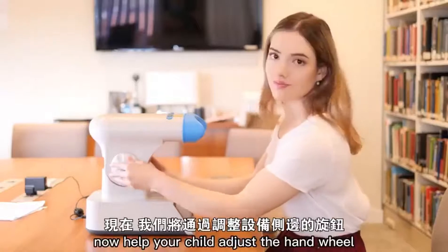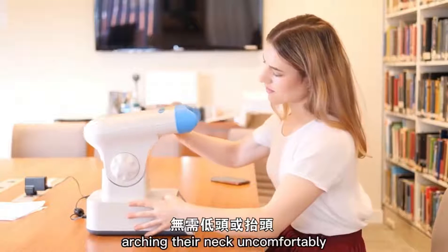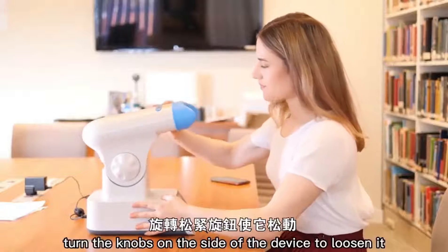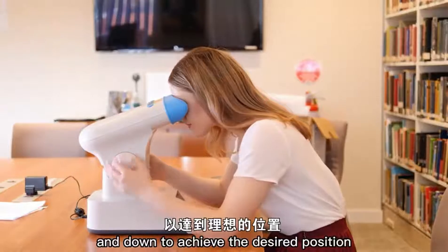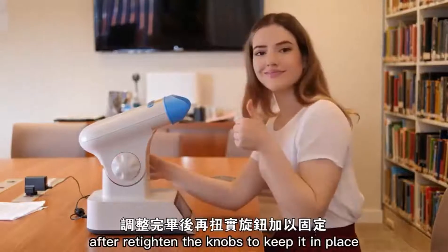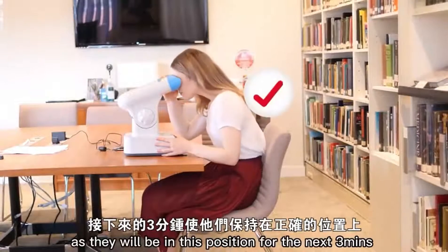Now help your child adjust the hand wheel to achieve a comfortable position so that they are looking forwards and not arching their neck uncomfortably up or down. To do this, turn the knobs on the side of the device to loosen it and move the eyepiece up and down to achieve the desired position. After, retighten the knobs to keep it in place. This should be done so that your child is not straining their neck, as they will be in this position for the next three minutes.